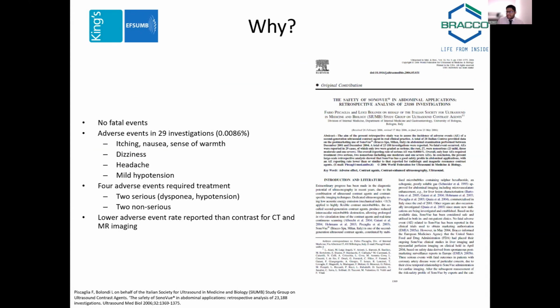And in addition to the development of this, there's also been development on the aspects of the microbubbles themselves, that transpulmonary stability. But we need to know first and foremost when we start something, is it the right thing to do? Well, we'll come on to that, but it's certainly safe. This was the original study that was showing 23,000 patients with a very minor adverse reaction rate. And as we've heard now, that 0.0086% has actually reduced. It's actually even safer in larger scale studies than we knew before.